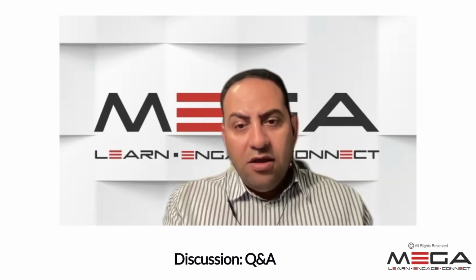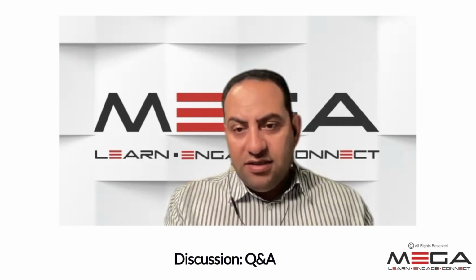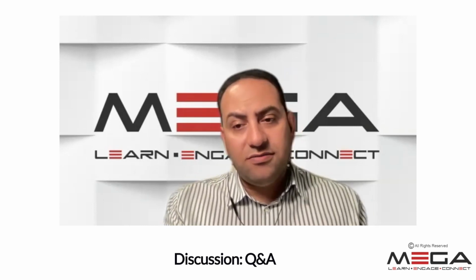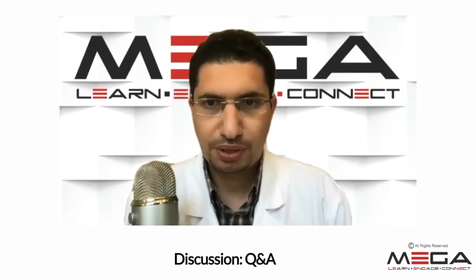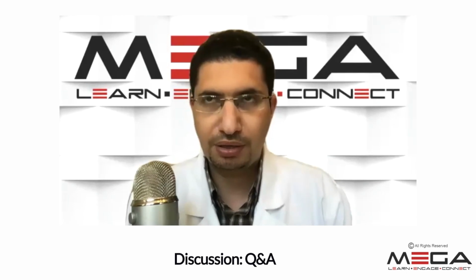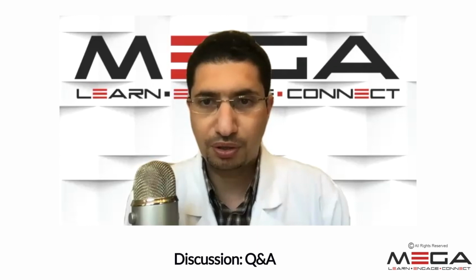Okay. From the question box, Dr. Burhan Kazal: does the American Heart Association, American College of Cardiology accept sono pulse check as a guidance or a guideline to stop resuscitation in cardiac arrest? So there have been publications that have shown that if you have zero cardiac activity, like a cardiac standstill, the rate of return of spontaneous circulation after that cardiac arrest is very low.